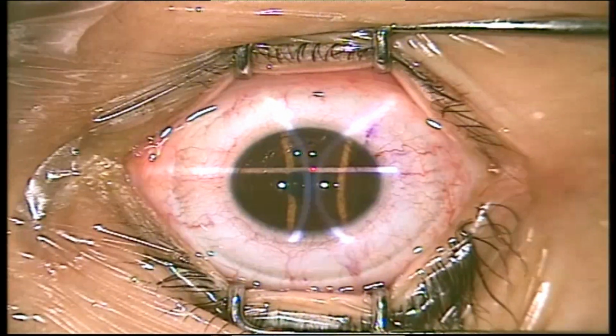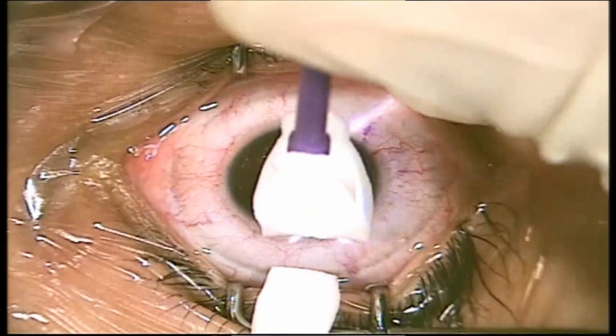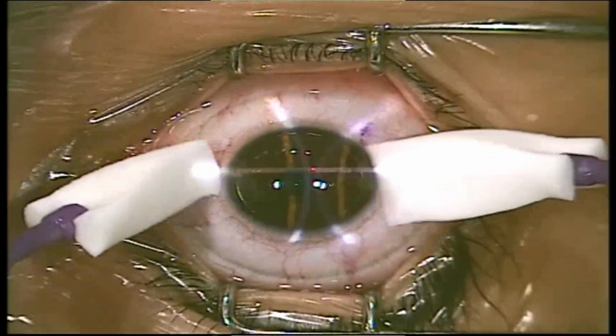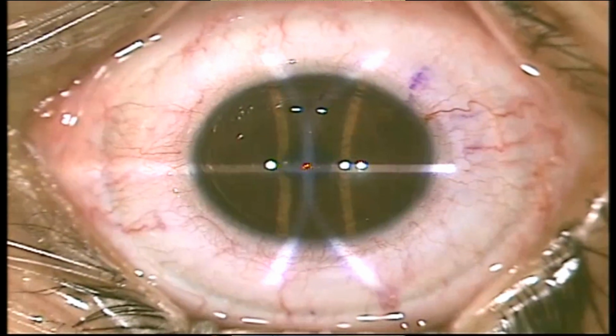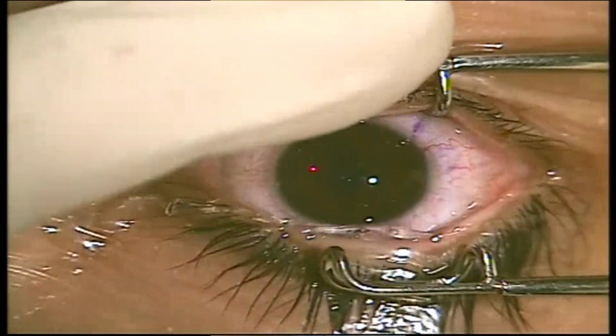The next step at the end would be to flatten the flap over the surface of the cornea, first downward to up and then side to side. This is the time when we remove all the striae in the cornea, and then you look through the slit lamp later on to see that the flap has joined to the cornea. This is the end of typical surgery in these patients.